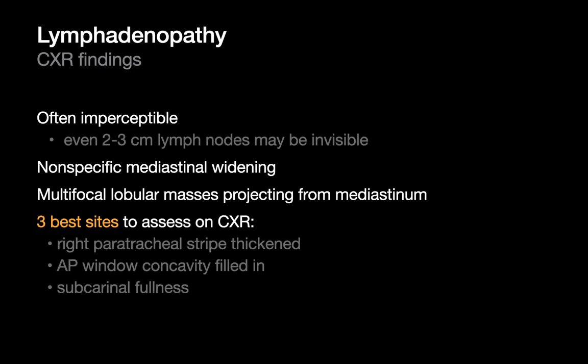Lymphadenopathy is the most common cause of a mediastinal mass. On chest x-ray it is very often invisible; however, there are some high-yield anatomic sites we should always try to assess: the right paratracheal stripe — whether it's thickened or not — the AP window, whether that concavity is filled in or not, and subcarinal fullness. The right paratracheal stripe is usually a very thin stripe, less than 2 mm, basically a thin white line on a PA chest x-ray, created by air within the right lung and air in the tracheal lumen bordering the thin right lateral tracheal wall.